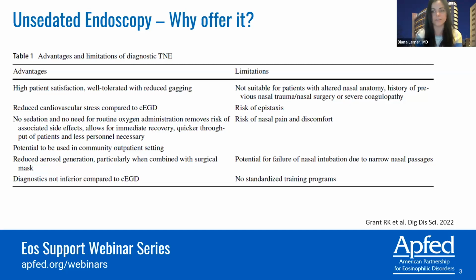Advantages are that it's a high patient satisfaction procedure. It's generally very well tolerated, with some reduced gagging, as we know may be caused by some other methods. There's reduced cardiovascular stress in patients who are high risk. No sedation is required, no monitoring, and potentially it can be used in an outpatient setting. In the event of a COVID type event, there is less aerosol generation with this procedure than with intubation or anesthetized patients.